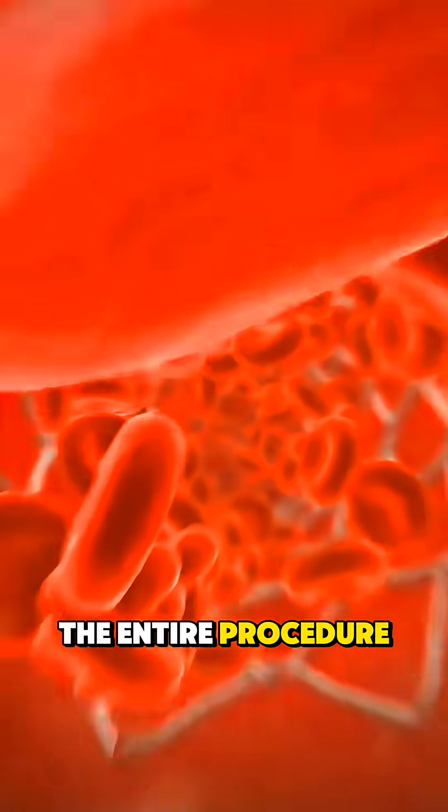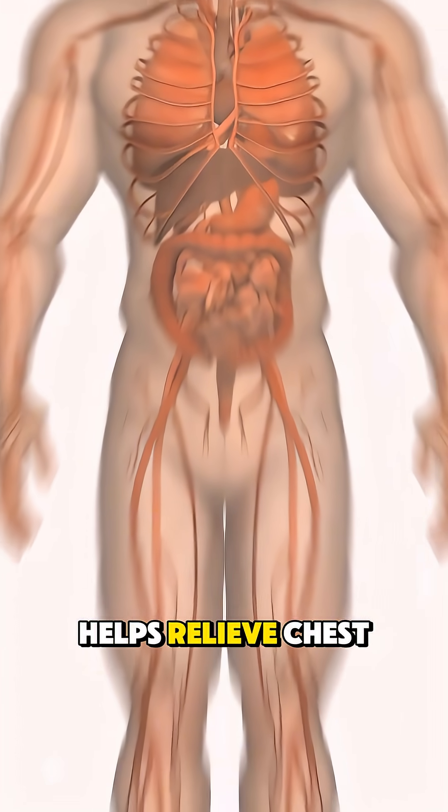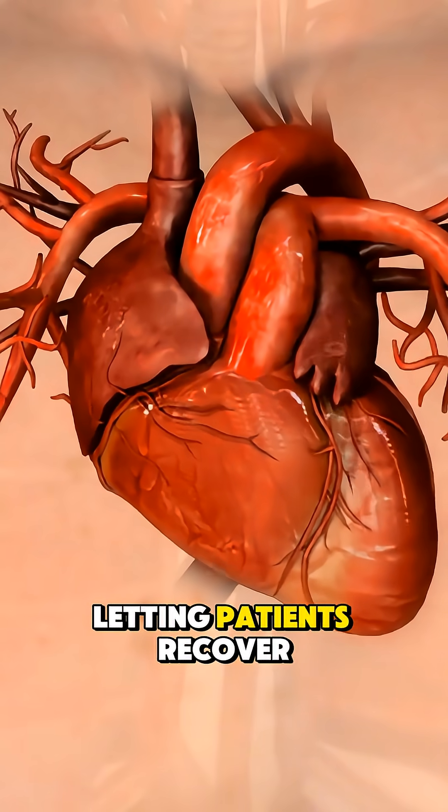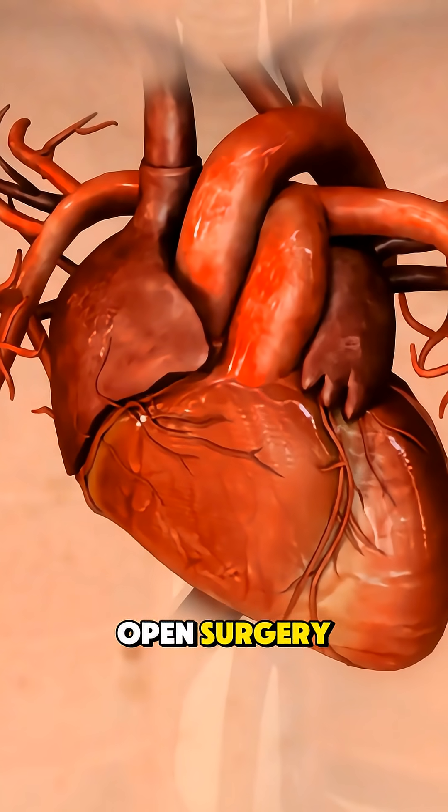The entire procedure often takes under an hour, helps relieve chest pain, and can prevent heart damage, letting patients recover much faster than open surgery.